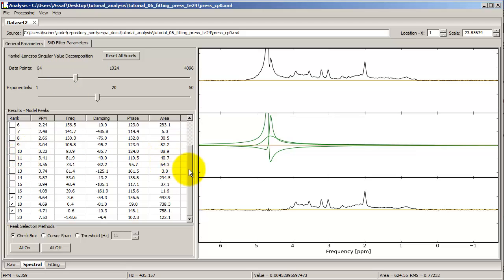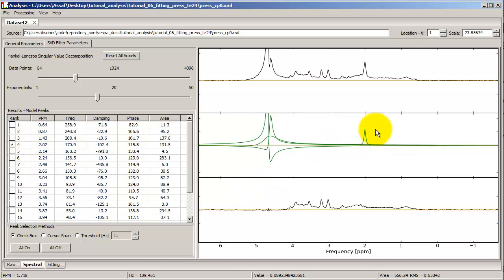Now, for example, I can scroll up a bit. You can, by the way, sort this according to frequency, damping coefficient, phase, whatever you want. I'm going to sort it by frequency. And for example, looking at this peak here, number 4, I see there's something at 2.02, and this is probably the NAA singlet. And I can turn it on, and you can see that here it is in the reconstructed SVD spectrum. And actually, when we look at the bottom spectrum, we see that the NAA peak has disappeared because we've basically chosen to exclude it.